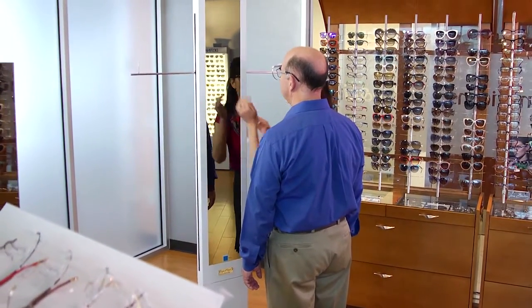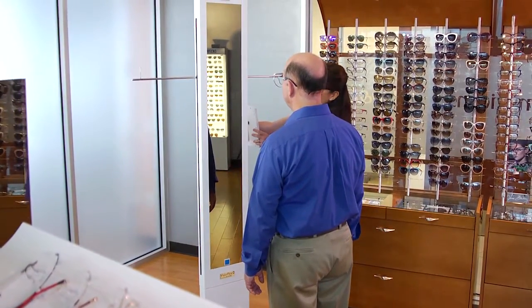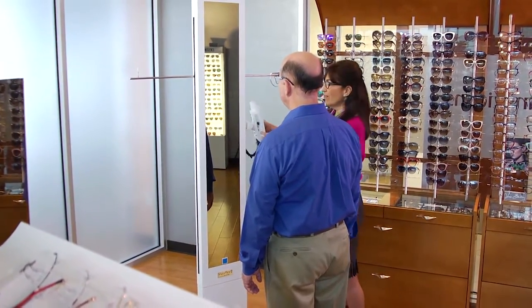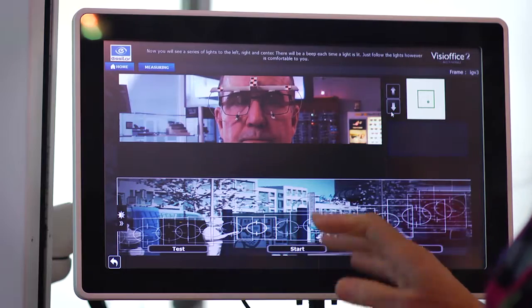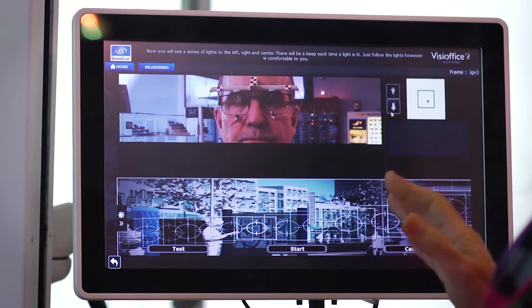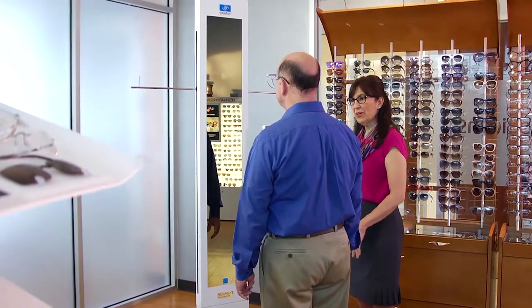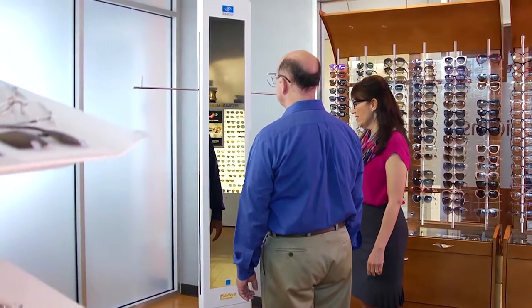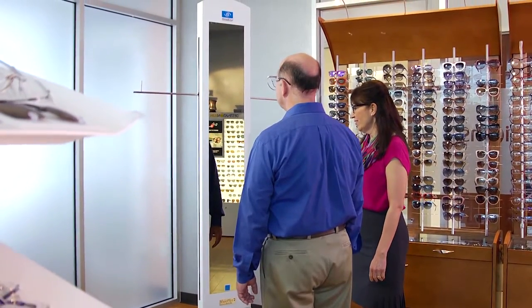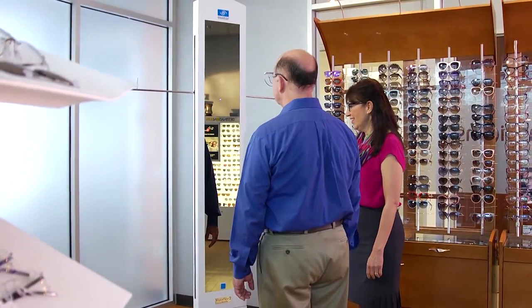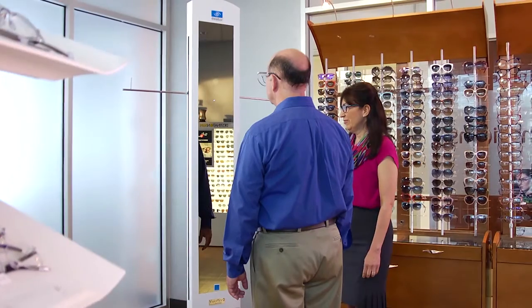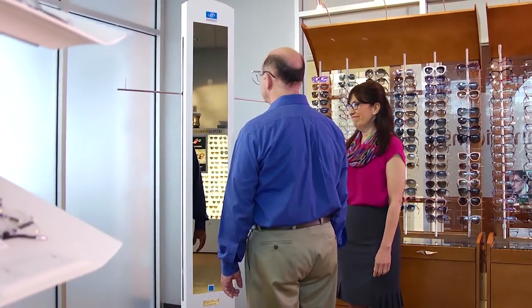Explain to the patient that they're going to see a series of lights that appear at either end of the arms and in the mirror. They should watch the lights however it's most comfortable. If necessary, you can perform a test for them to practice.